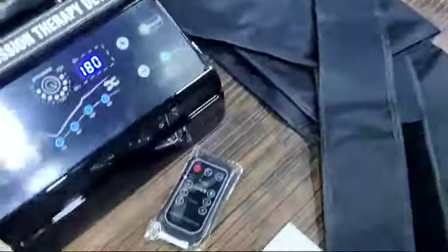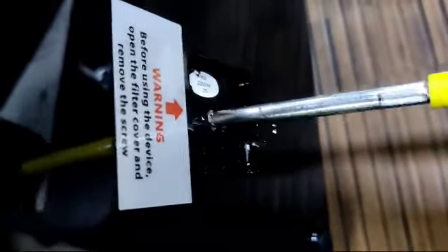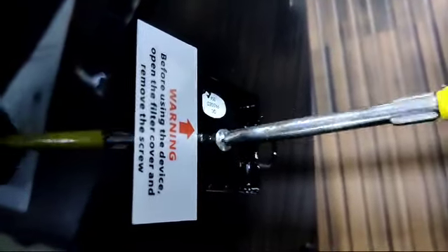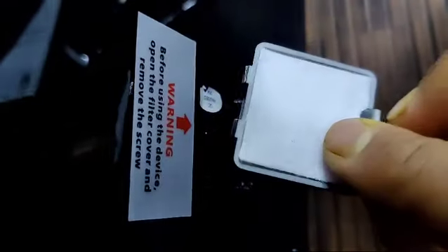I am showing you a demo of how to use the machine. Before using it, go to the backside of the machine where the air comes in. You have to open it — there is a screw there. Since this is a new machine, you must remove that screw. This is the hole from which the pump gets the air. Take it out and place the filter over here.